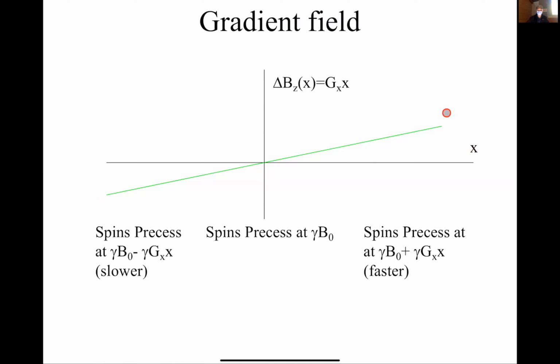Now, one of the pre-lecture questions was asking what gradients do. Most people got the fact that they impose spatial variations in the frequency and phase. But a number of people did say that they imposed variations in spin polarization. That may be a trick question, because you might think polarization has to do with the phasors or something like that. But that's not the way we use polarization in this course. Polarization really refers to how much magnetization there is available. The polarization is due to the main field B0. It's not governed by the gradients. Okay.